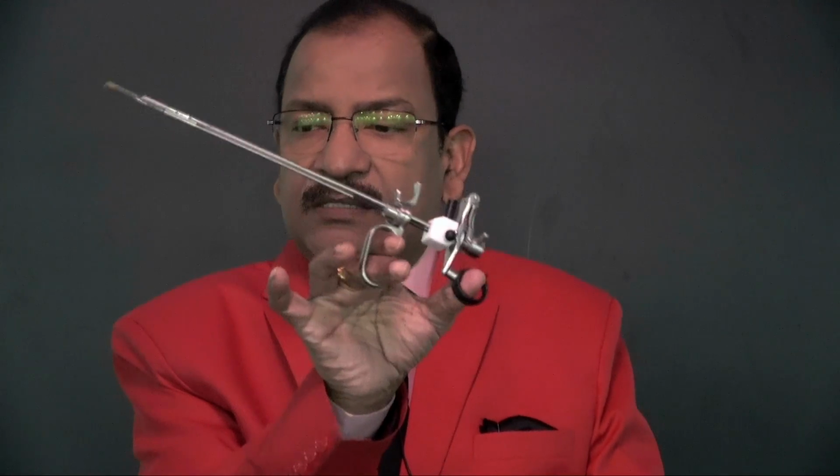It has active and passive, 2 types of working element. This is the electrode, and you have different types of electrodes: loop electrode, Collins knife, roller ball, a straight knife. These are the different types of electrodes which are available.